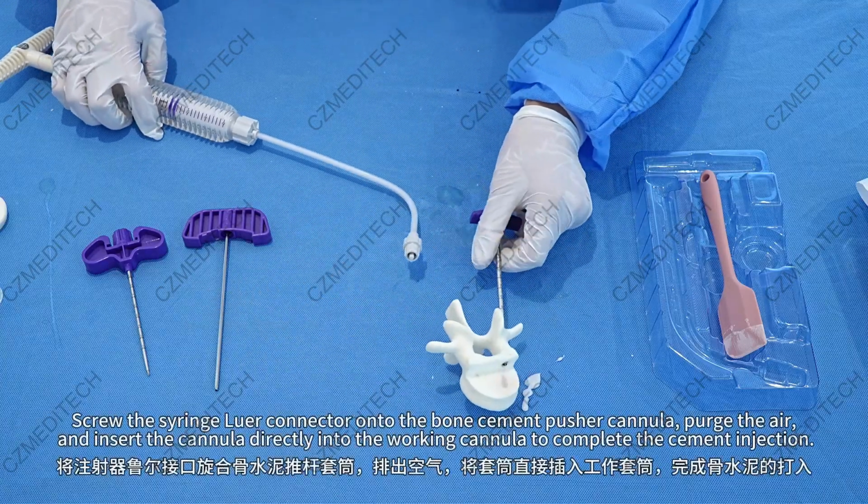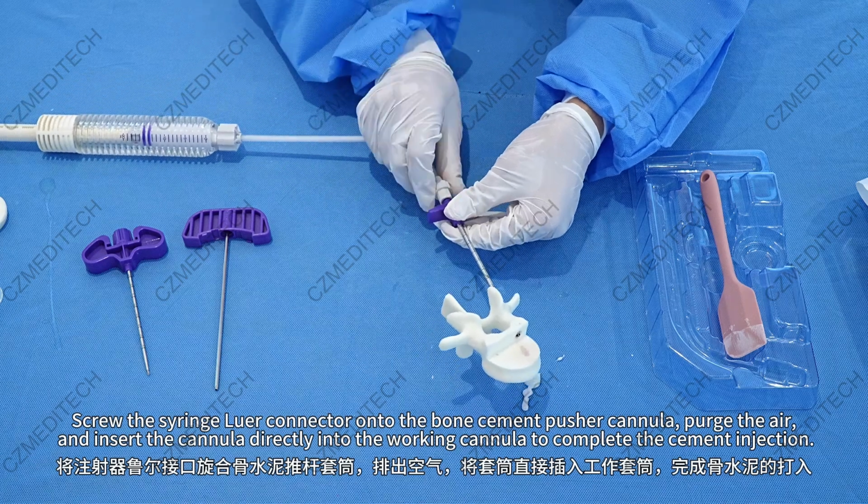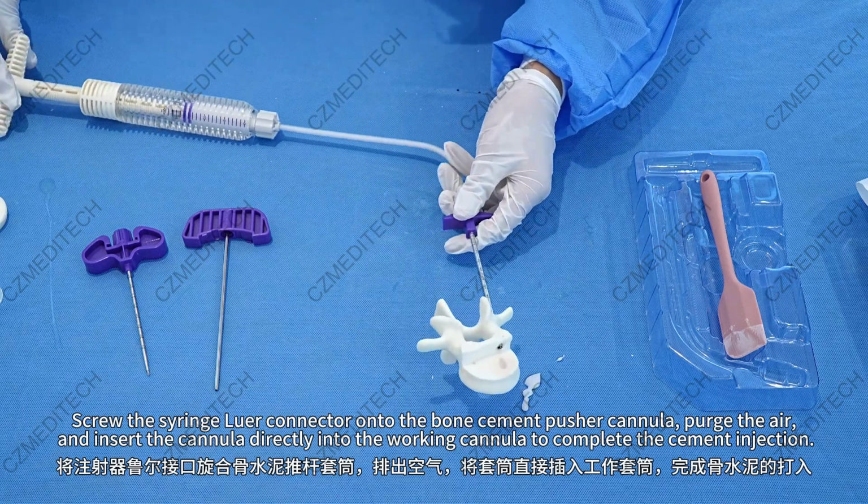Screw the syringe luer connector onto the bone cement pusher cannula, purge the air, and insert the cannula directly into the working cannula to complete the cement injection.